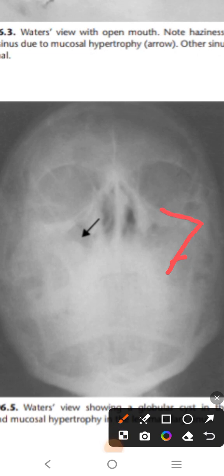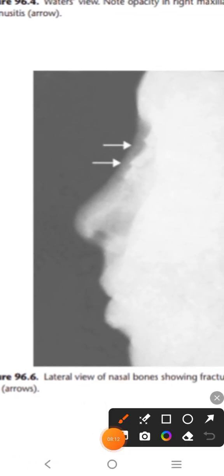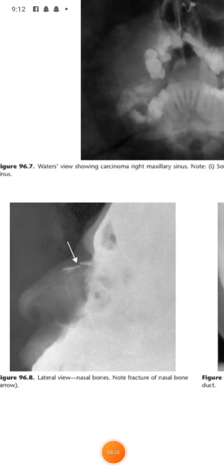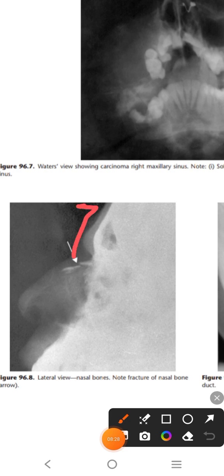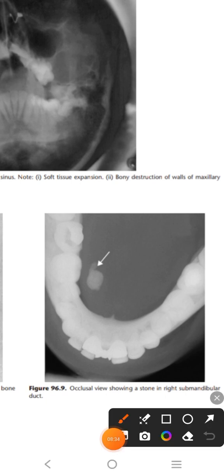This is the lateral view of the nasal bone. The lower two-thirds of the nasal septum is made up of cartilage and the upper one-third is bone. Two arrows are shown indicating fractures at those places - the nasal bones are fractured. Here is the lateral view of the skull and the occlusal view showing the floor of the mouth. The radio-opacity shown here can be a stone in the submandibular duct.